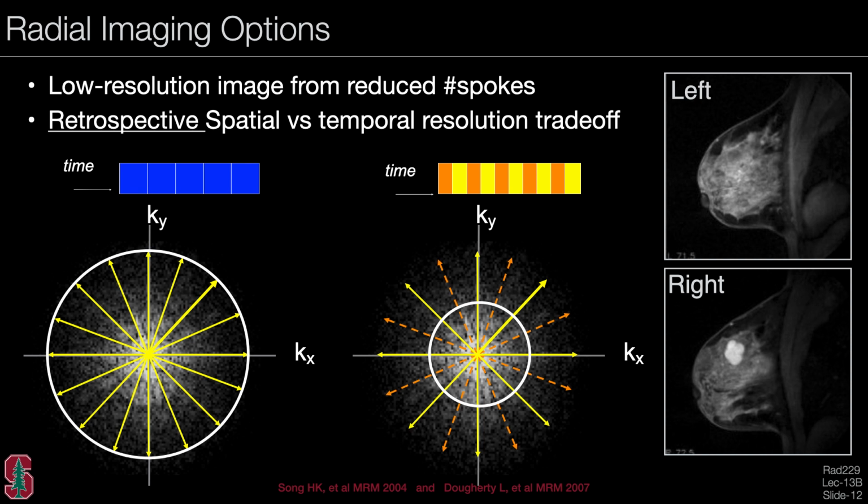And this gives us very sharp images with a high frame rate. The difference between doing this and fully sampling is actually hard to notice, because a lot of the information is at the low spatial frequencies, and that's why it's so important to sample the low spatial frequencies very frequently. Again, in this approach, we can consider the temporal footprint, and the temporal footprint here would be just 2 frames in this example.